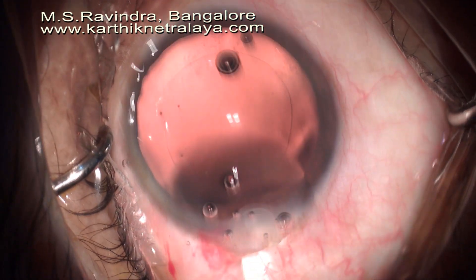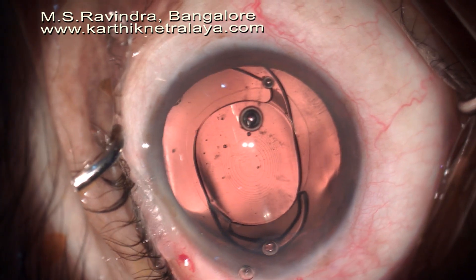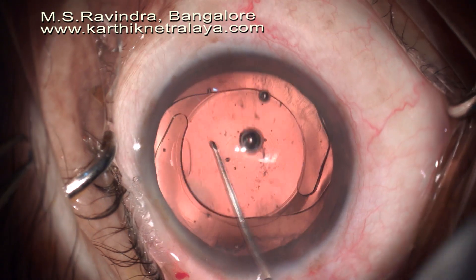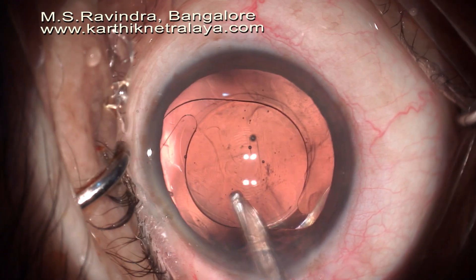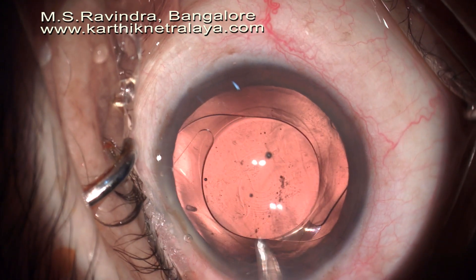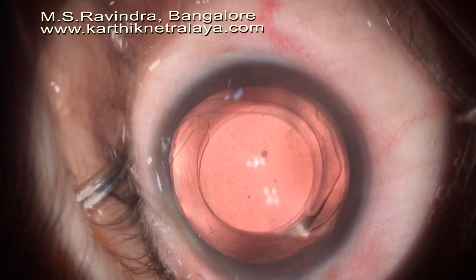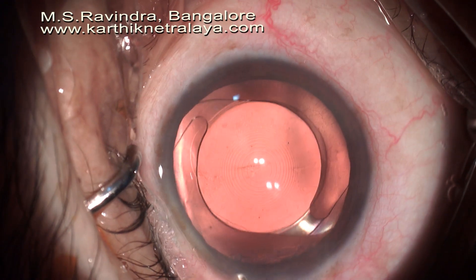This patient had opted for a multifocal lens, and I could comfortably place it in the capsular bag. The weight of the intraocular lens is perhaps one tenth or even less than the weight of the cataract, so when this capsular bag had been maintained for a year's time, I felt the very minuscule weight of the lens could be easily managed by the attached zonules. There is a possibility of capsular contraction syndrome in this patient, which can be managed at a later stage with the YAG laser. I am supporting the lens such that the capsular bag which is maximally dehiscent is supported by the haptics.